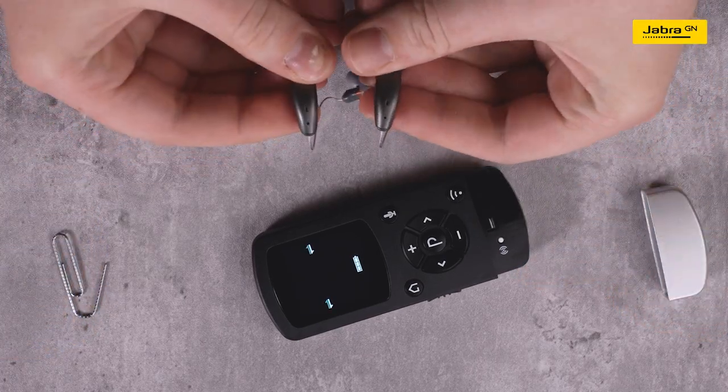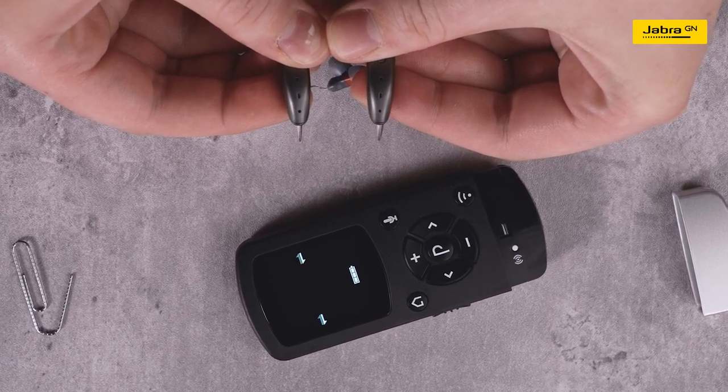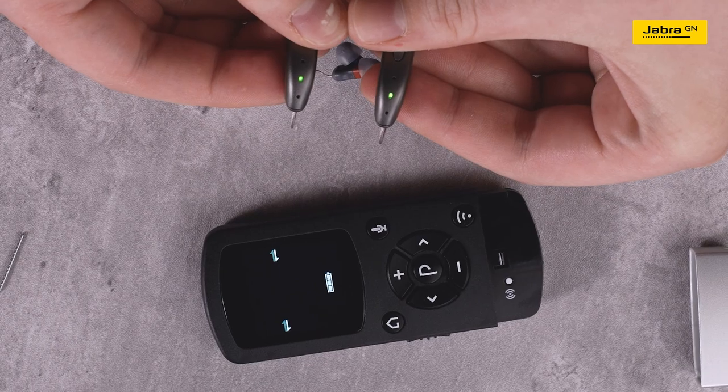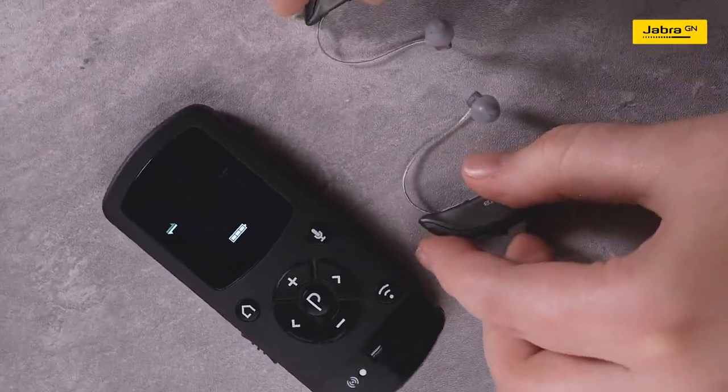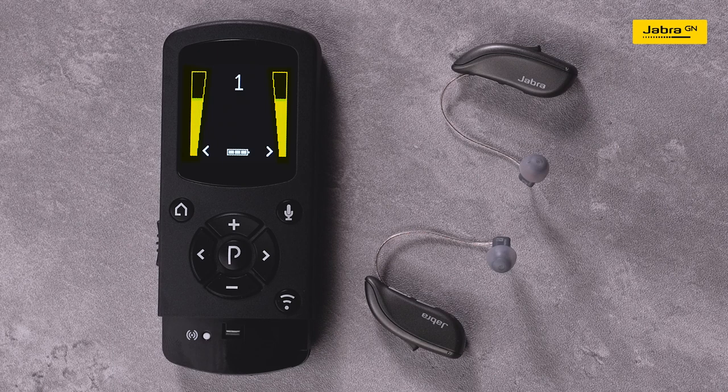Press and hold the push button on your hearing aids until the LED turns solid green. On the Remote Control 2 screen, there will be one volume bar located on either side of the screen indicating both hearing aids are connected. Your hearing aids are now paired to the Remote Control 2.